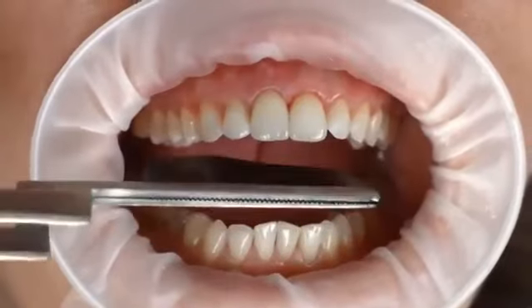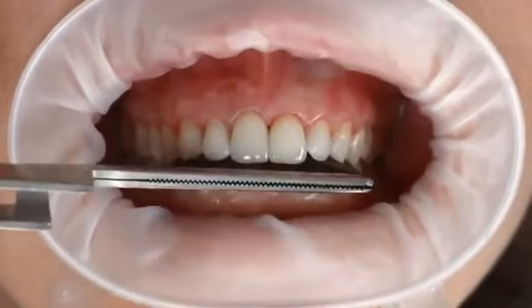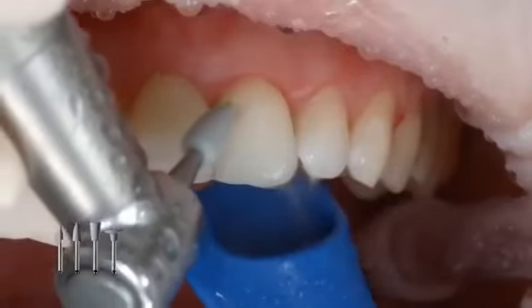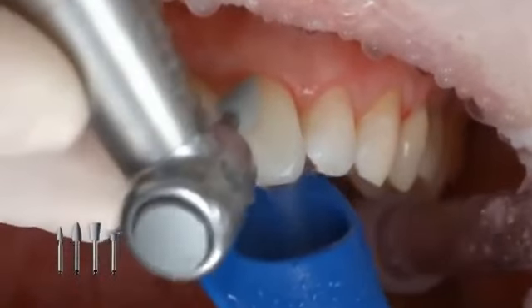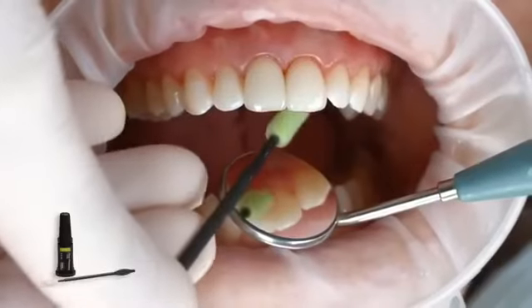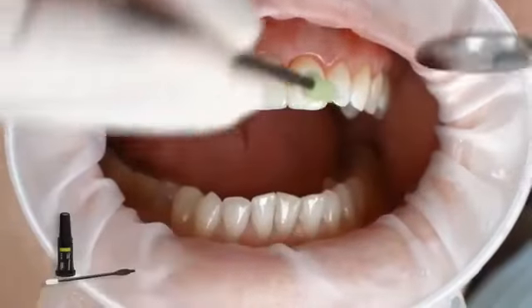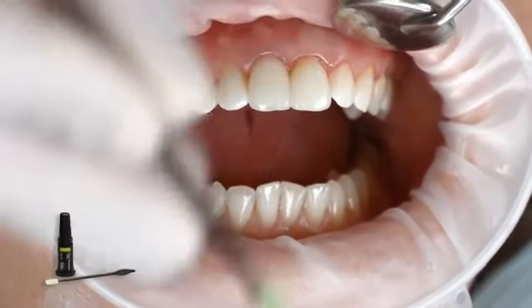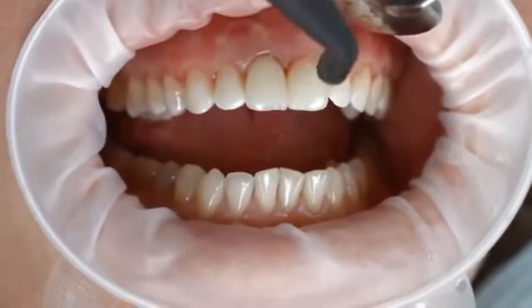After having removed the rubber dam, check occlusion and functional movements, and make adjustments if necessary. Polish the restoration margins with polishers, such as Astropol, or with discs. As a final step, apply a thin layer of Fluor Protector S with a Vivabrush or a conventional brush. Use the air syringe to disperse and dry the varnish.